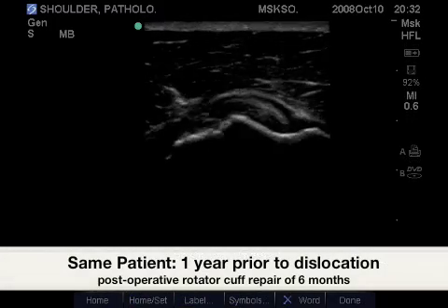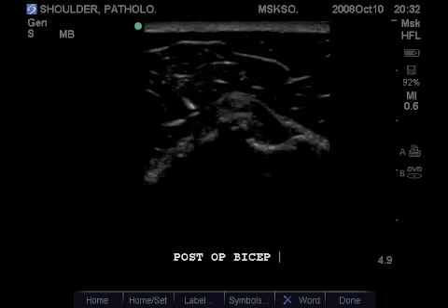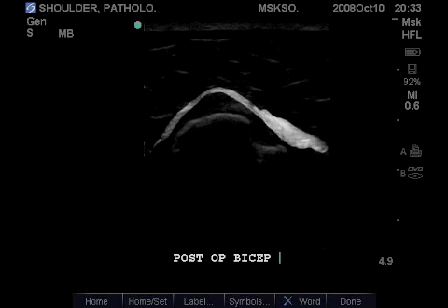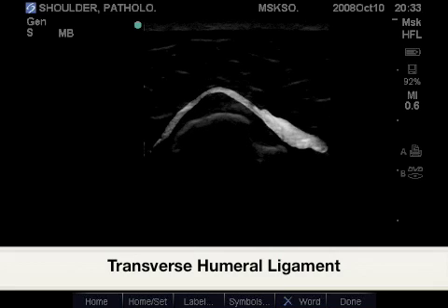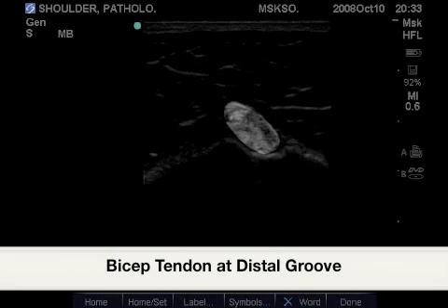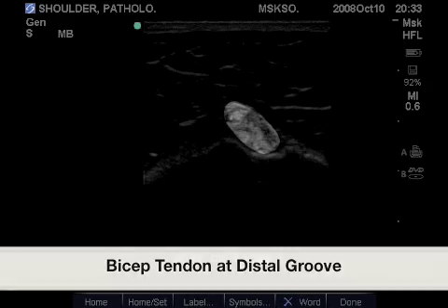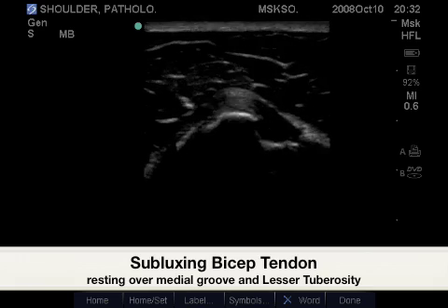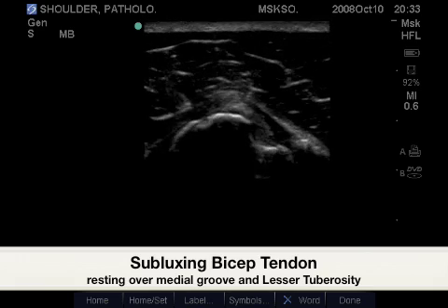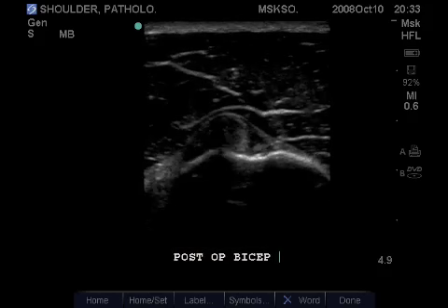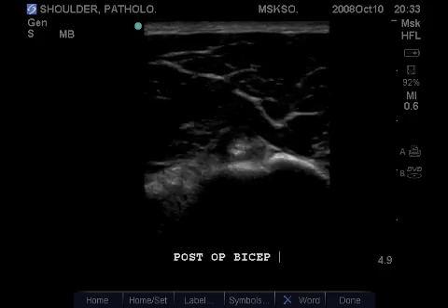Here we have the same patient approximately one year prior to the exam. Highlighted is the lesser tuberosity and the bicep groove, also the transverse humeral ligament. As we scan distally, we see the bicep tendon subluxing out of the groove. As we scan even more distally, we see the bicep tendon not quite anchored as closely to the humerus as we would like to see it.